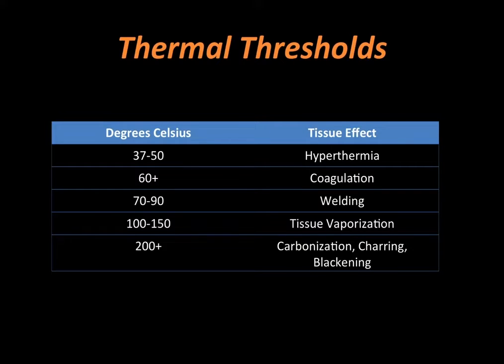And if that happens, we have the ability to turn the power of the laser down a bit so that it doesn't char as much. That's probably the one area that is a learning curve: we want the diode laser to work faster, but we don't necessarily need it to work faster. We don't want to overheat the tissue. It takes a little bit of practice to really maintain the health of the tissue and get the final result that you want. You don't need charring to have sufficient vaporization or cutting of the tissue. An electrosurge will obviously char the area.